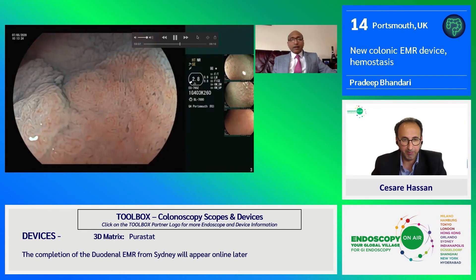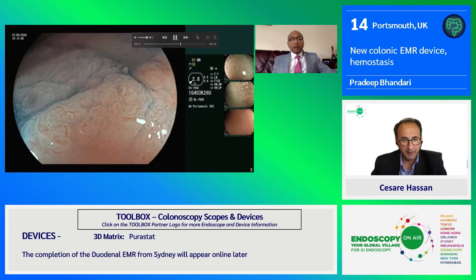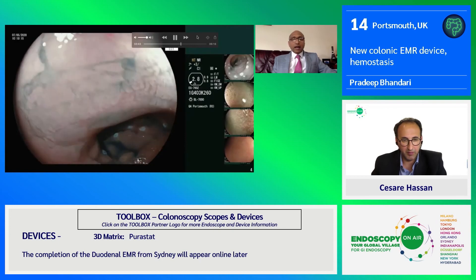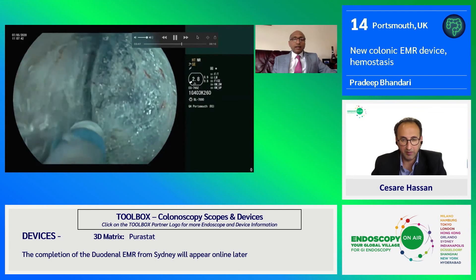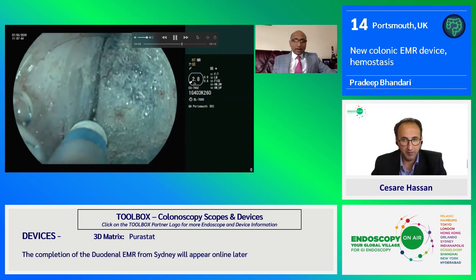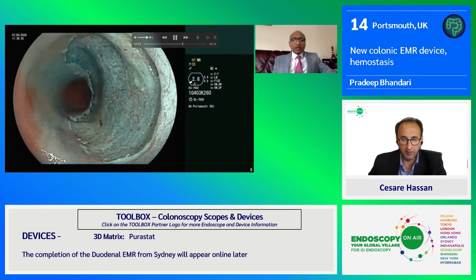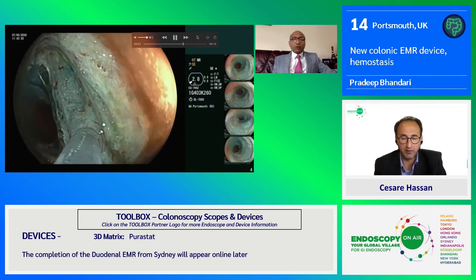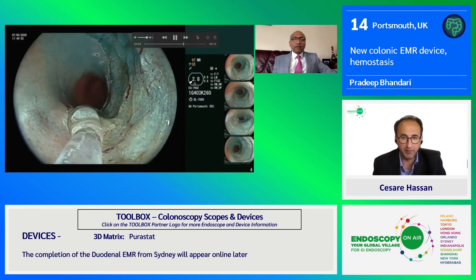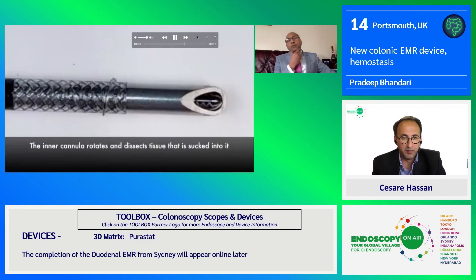This is a very difficult lesion in a colitic bowel. The biggest challenge was recognizing the boundaries — it took us half an hour to find the margins and mark them — then we performed underwater or saline immersion ESD to resect the lesion. Healing can be challenging, and during the COVID period it is very difficult if patients come back with a delayed bleed, so we applied PuraStat.